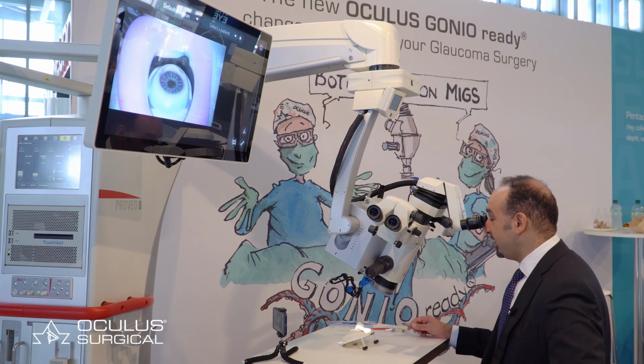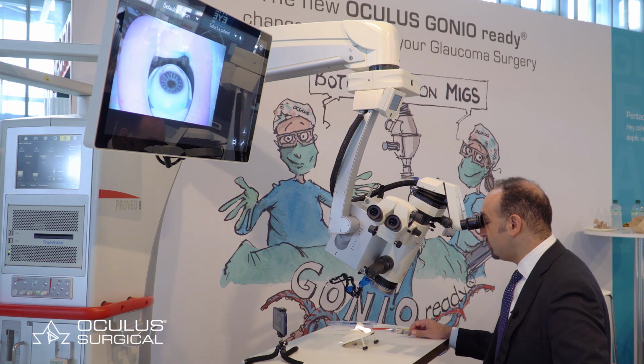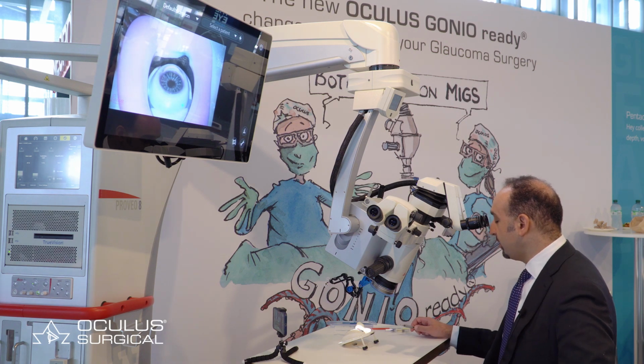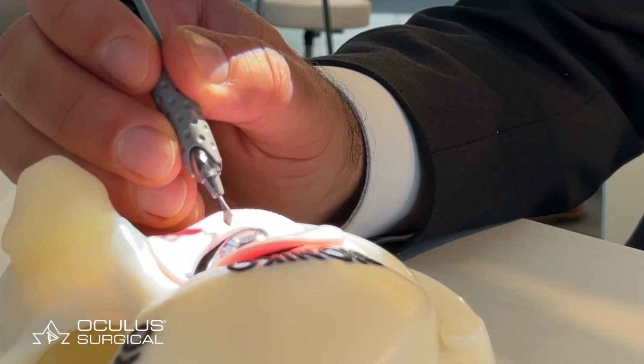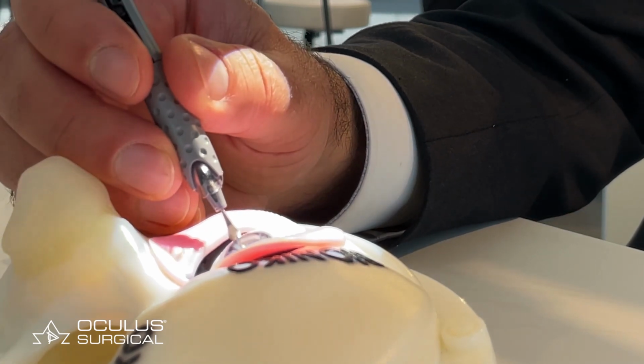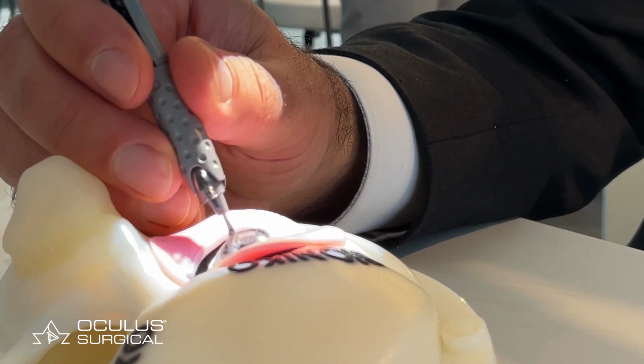Okay, we're getting ready here to demonstrate use of the Gonio Ready for performing a Hydrus procedure in a model eye. This is a BIONIKO eye here that we're demonstrating. As we get ready to perform our MIGS procedure, in this case a Hydrus stent, we'll start by making our incision here directed nasally. You can see that incision there.